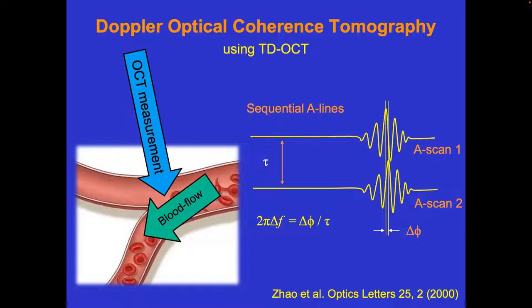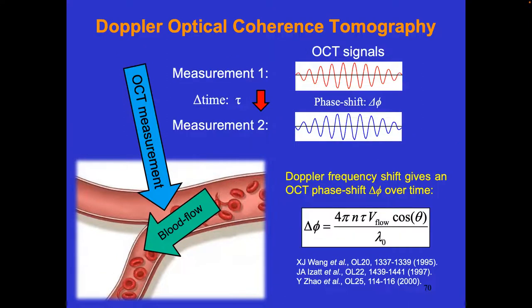But the interesting thing is that we have this interference pattern underneath. We can look at the phase of this interference pattern and compare the phase of these two scans, and realize that if you go from a maximum to a minimum in your interferogram, it's a motion of about half the wavelength in your sample arm. Half a wavelength motion of a scattering object creates a full wavelength path length difference, a two pi phase difference. So that phase is very sensitive to very small motion, and we can measure that phase difference between these two profiles. And if you take the phase difference and divide by the time delay between these two scans, by the derivative, you get something that has the dimension of a frequency shift. You can go through all the calculations, but this turns out to be exactly the Doppler shift that you expect for a moving particle. So we can convert these phase shifts into frequency shifts, or Doppler shifts.